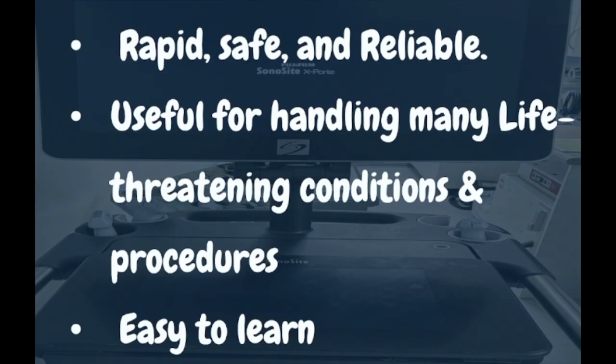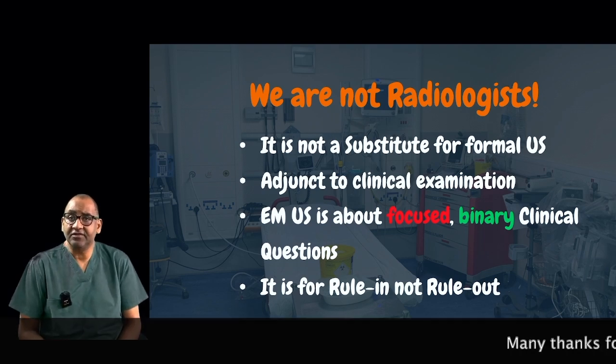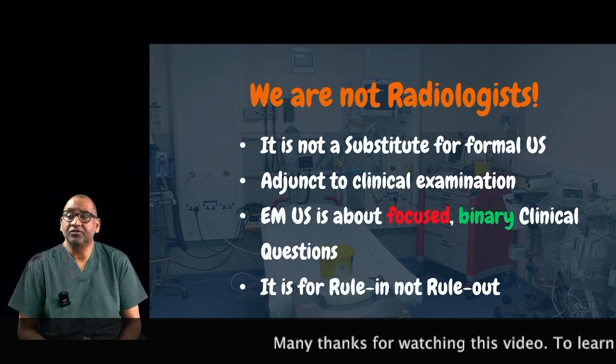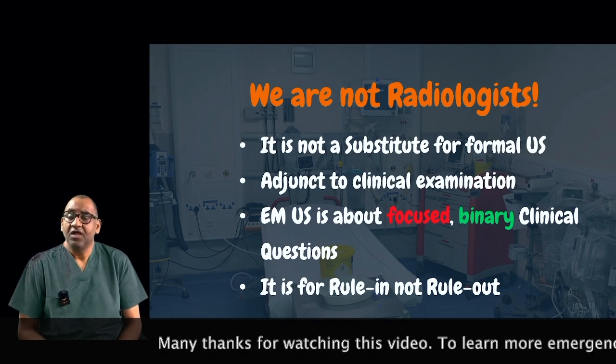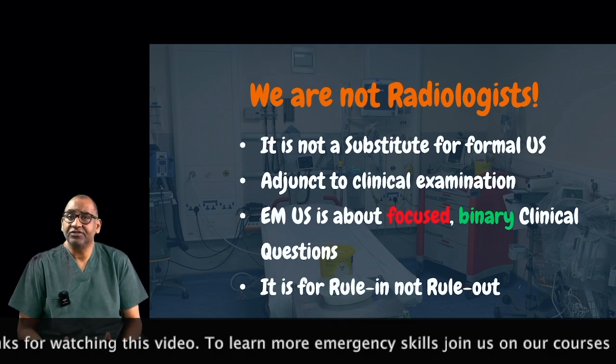And it's easy to learn, and this is the good news. But the principles are that we all need to know that we are not radiologists, and it is not a substitute for the formal ultrasound. You need to remember always that it's an adjunct to your clinical examination and history.